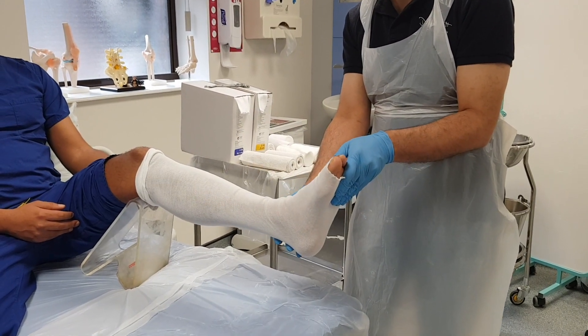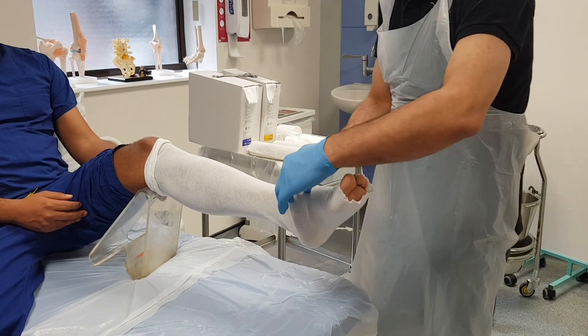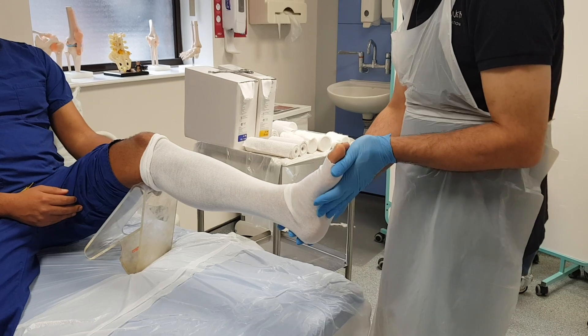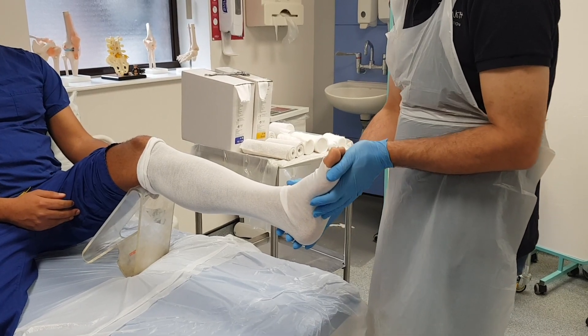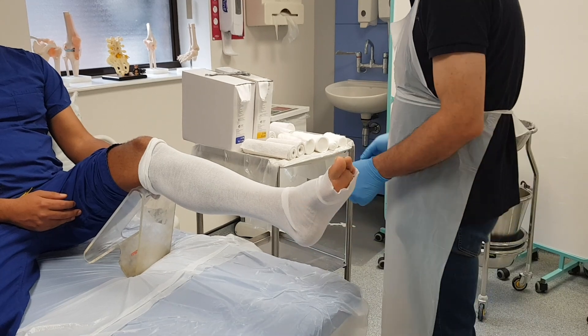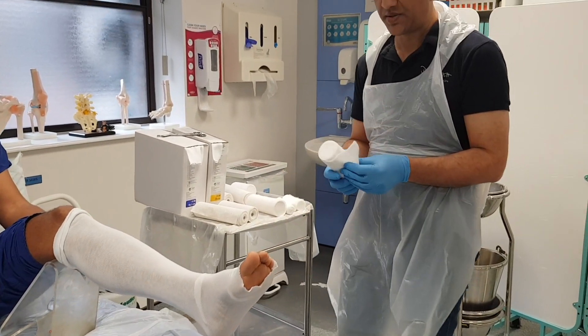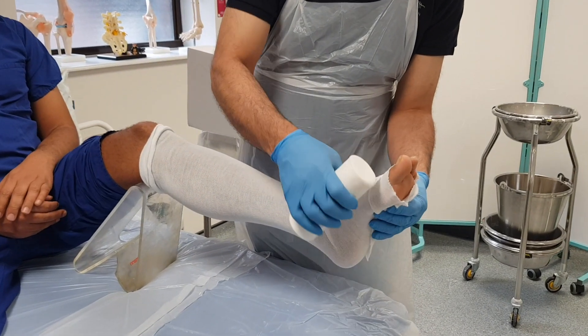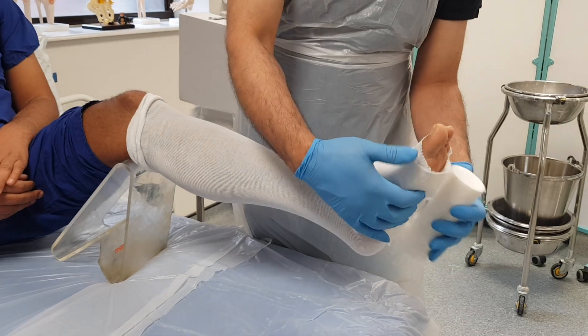I want the foot to be at 90 degrees. This can cause some wrinkling of the stockinette, so we'll fold that over so there's no fold down to the skin. Next I'm going to apply the wool, and I want the wool going down to the metatarsal heads so I want two complete layers to protect the skin from the plaster.